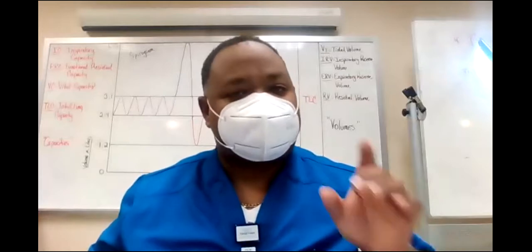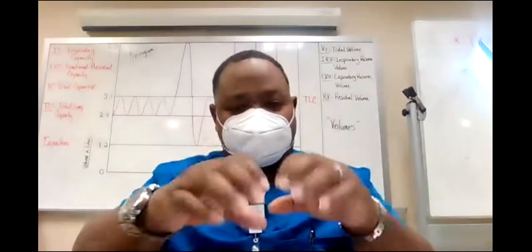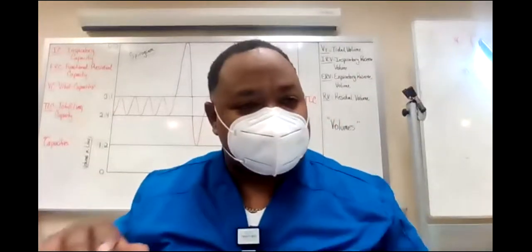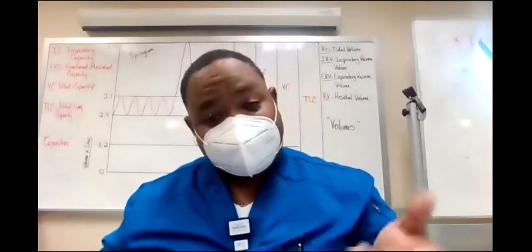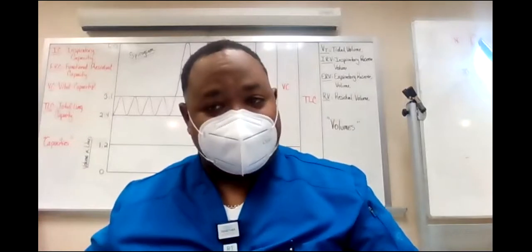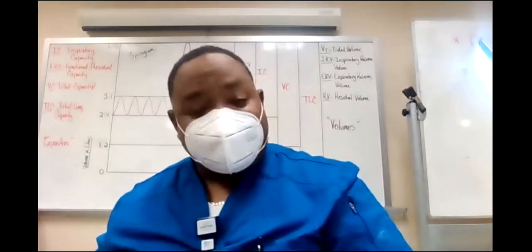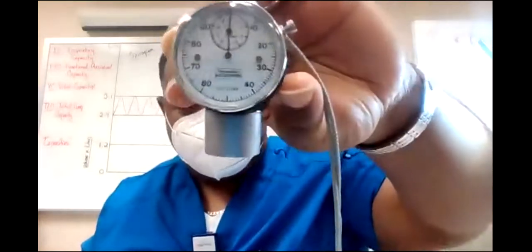Okay, in a pulmonary function test, we put the patient in a closed-in box and they sit in a chair with a big mouthpiece in front of them, and the PFT respiratory therapist will do all types of studies, okay? So yeah, that's fine. I didn't know what you were saying, but yeah, body plethysmograph. That is a body box, so yes. But basically for bedside, we use a Wright's respirometer, and this is what it looks like. This is a respirometer.